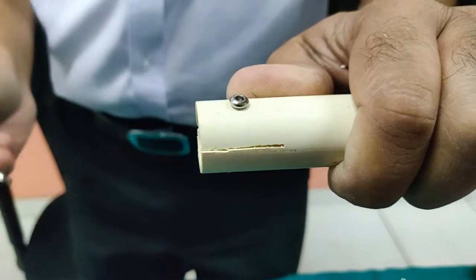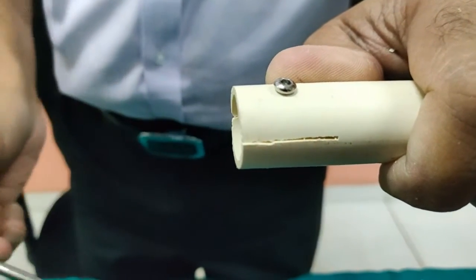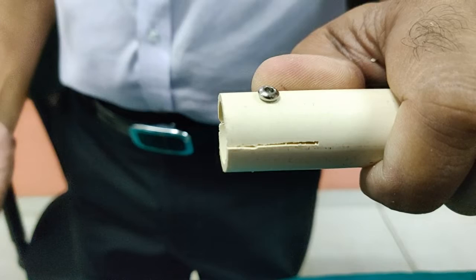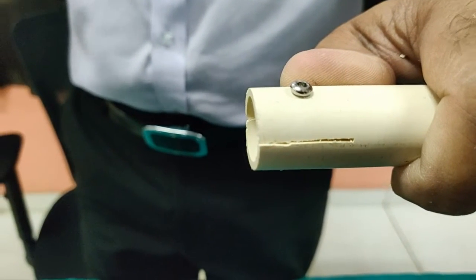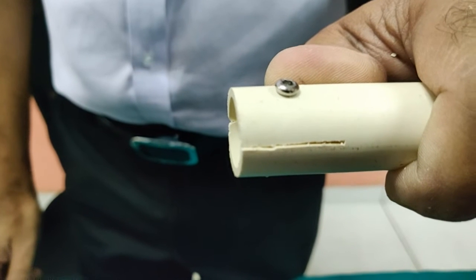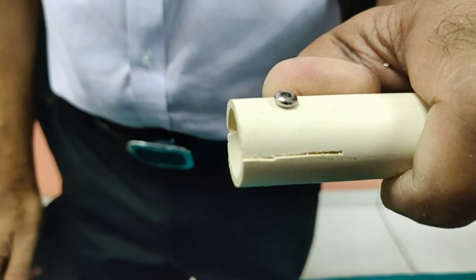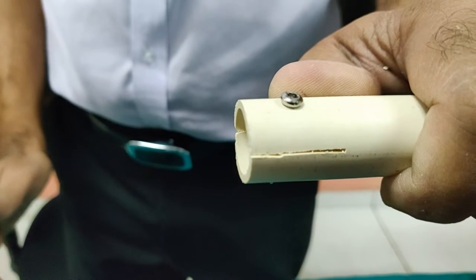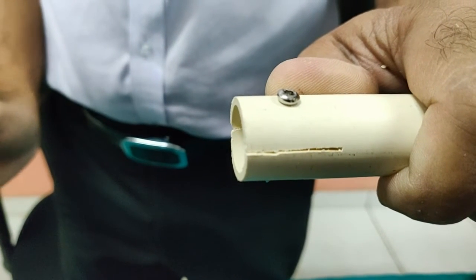You can now see that the fracture site is nicely compressed. Because this is plastic with very thin margins, it doesn't demonstrate as well as it would in a real bone, but this is the principle you should follow when applying a lag screw.